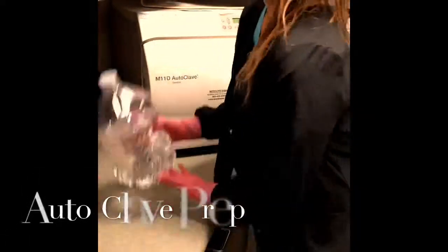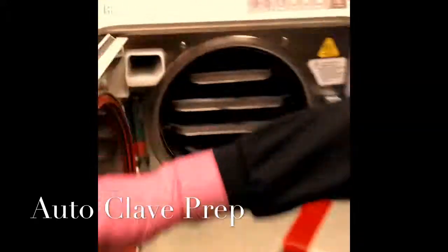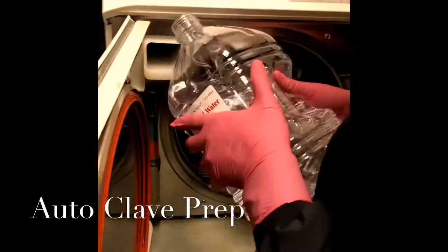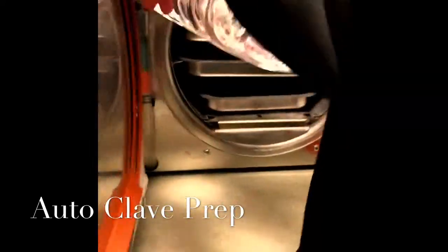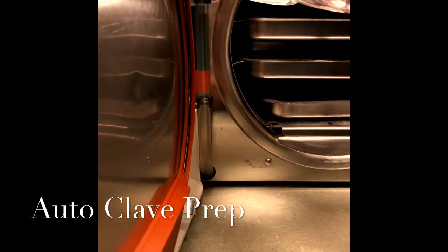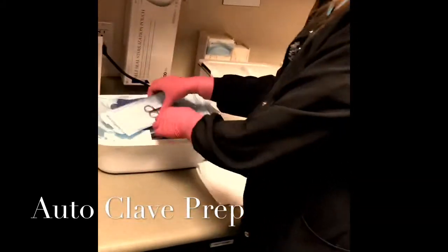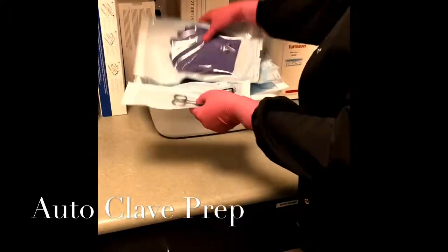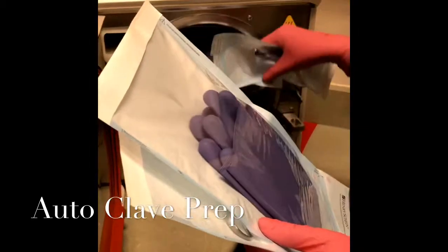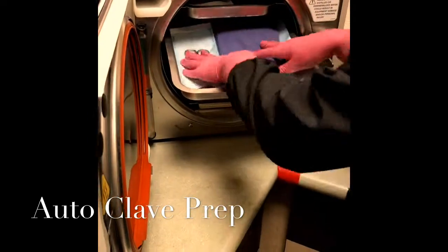Here we are prepping the autoclave before we go ahead and use it. We have our distilled water and we're making sure that the water is up to the green margin. If it appears too low or if there's not enough water in there that it hits the red, go ahead and fill it with distilled water until it's ready. After that is complete, you're going to go ahead and get the bags that are dated and set them in the autoclave. Make sure not to bundle all the bags up or check for improper packaging. When that is ready, go ahead and insert the spore test and you could begin the autoclave.